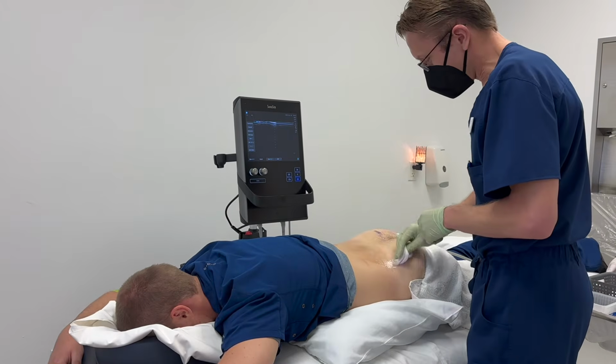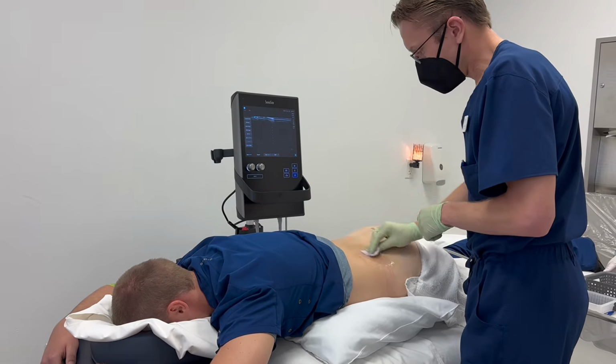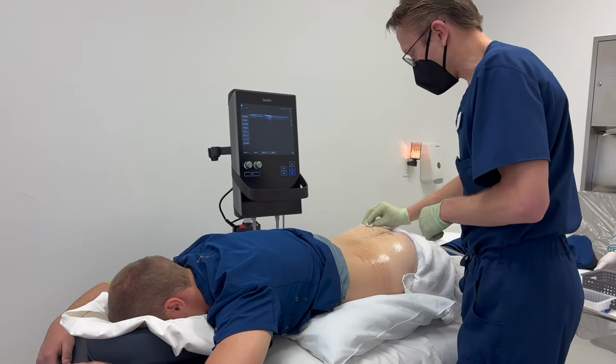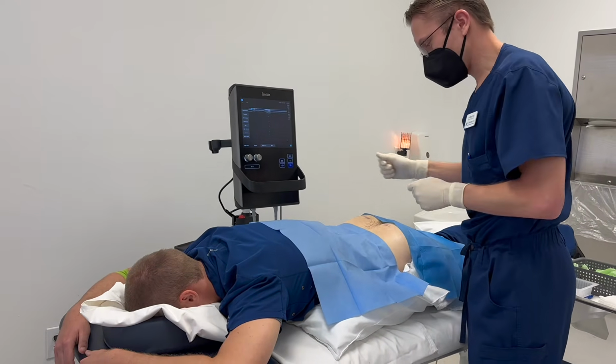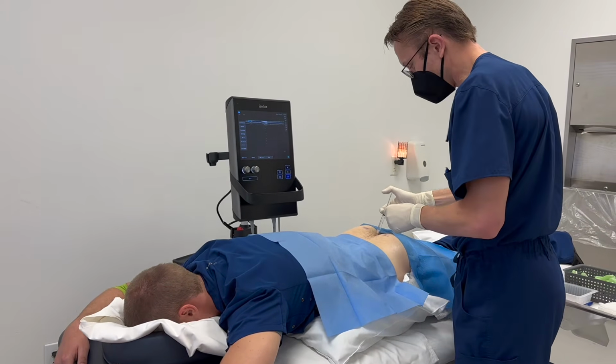I'm going to clean the area with sterilizing solution. This is the same type of solution that's used for surgeries. It makes sure that the skin has no bacteria and no other contaminants. So I'm setting up a sterile field to make sure that the whole procedure is sterile. We're going to numb up the area, a little poke.